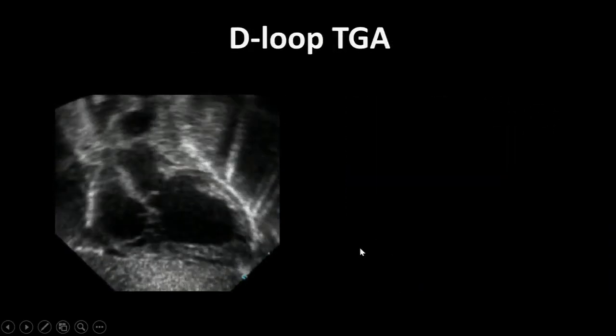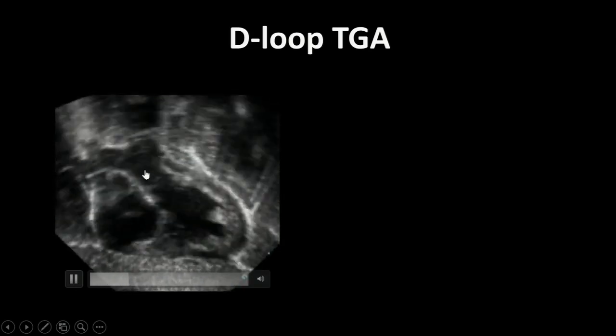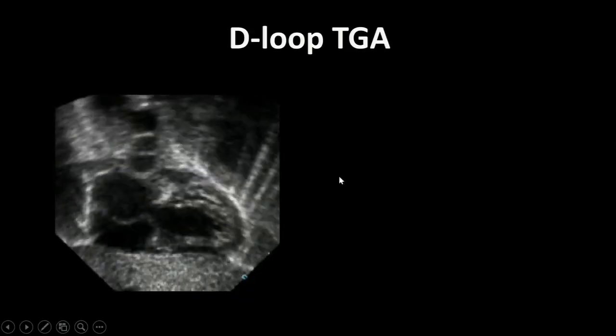Here's an example of transposition, subcostal sweep. We're now anterior, the right ventricle's over here, here's the left ventricle. I'll let it come around again one more time. If you follow the left ventricle, it goes out to the semilunar valve, goes up to this great vessel, and this great vessel is bifurcating into right and left pulmonary arteries. So LV going to the PA.